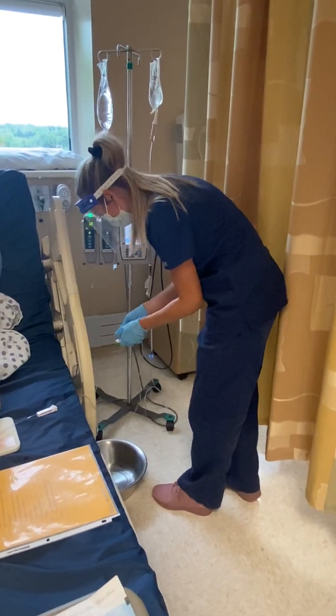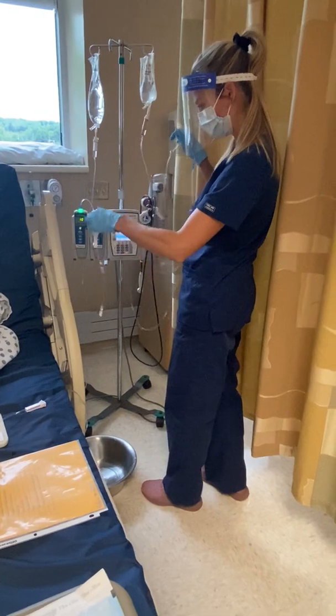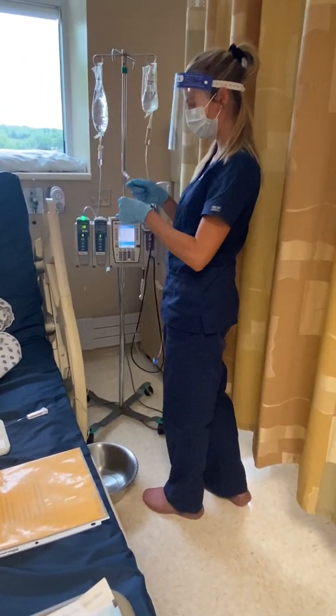All right, so then I just make sure that there's no bubbles in your line, and it looks like you're good to go there.